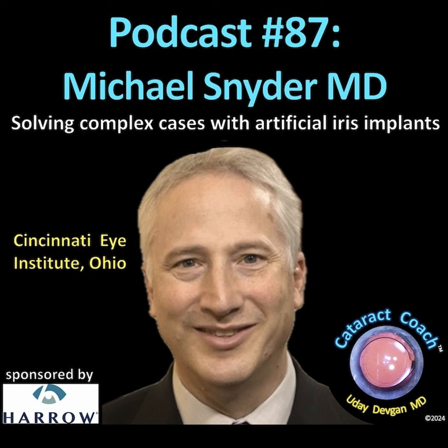Because when we're doing a primary cataract surgery, it's fairly straightforward to put in a Cionni ring or a capsular tension segment. If the same patient comes in as a routine cataract case 10 years down the road, reopening that capsular bag with the Soemmerring ring and with the fibrosis that's occurred over that time to try and place either a ring or segment can be a real hassle. Right. And in a patient that has already had a YAG capsulotomy, which after those years many do, it becomes nearly impossible.